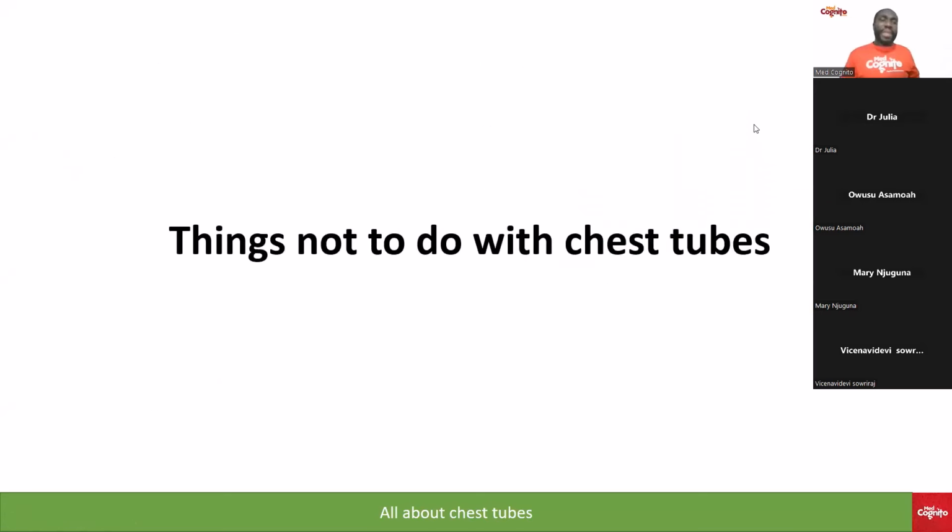Okay, I want somebody to summarize some of the points we've made so far. I said it should have intermittent bubbling, not continuous erratic bubbling. If there's continuous erratic bubbling, then maybe there's a problem. Okay, Prince. Can somebody summarize the significance of bubbling, the significance of the oscillation, and when I will call somebody to come and see the patient after a chest tube is inserted? What are the three things I want to see that will cause me to call somebody? I want somebody to volunteer.